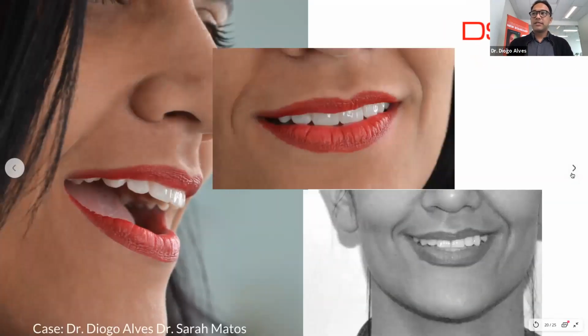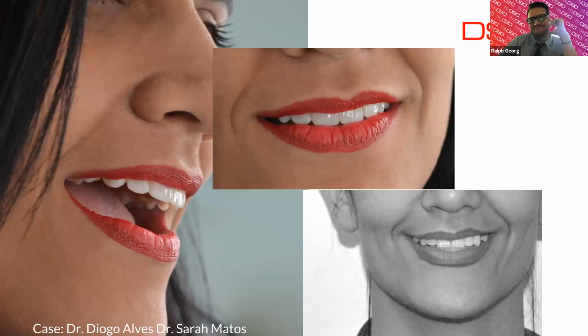Here we have my case. And if you guys notice the grooves in the anatomies, I didn't have to do a thing there. All that I had to do was the finishing and polishing, but I didn't change any of the anatomy because the anatomy was already done in the app. It was already there. Looks so natural. Natural shapes. That's wow. Correct.